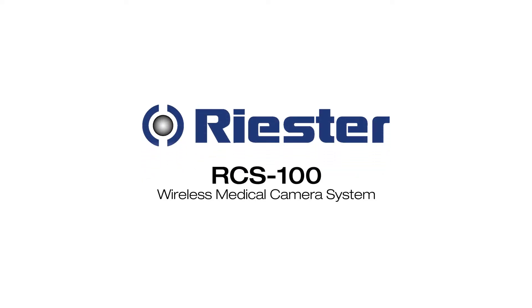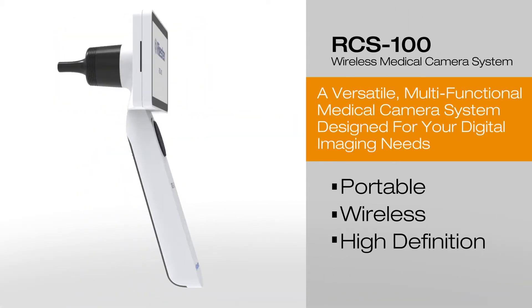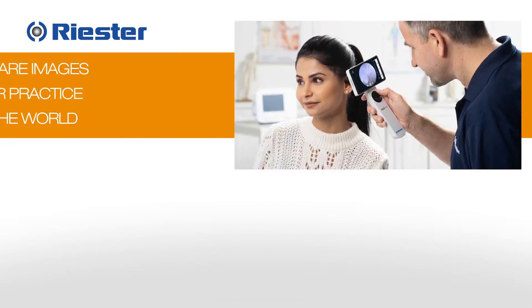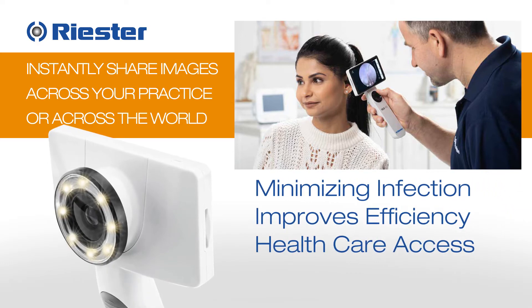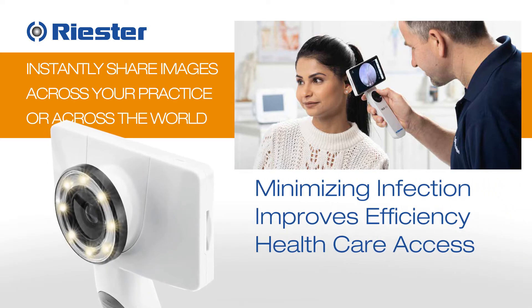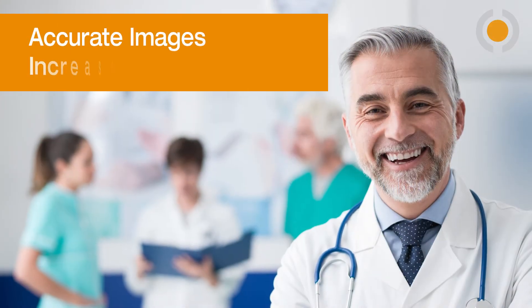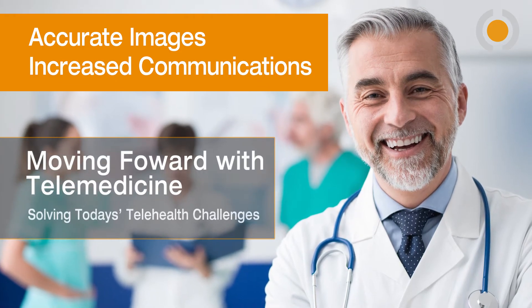The Riester RCS100 Wireless Camera System is a portable, versatile, diagnostic camera with multiple lens attachments. It provides instant video and image sharing across your practice and across the world. Minimizing risk of infection, improving efficiency, and access to affordable care are all benefits. The need for accurate images and increased communication is today's new normal.